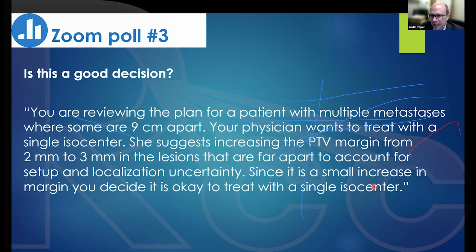Okay, we have a good response right now. I'm going to share these results. I can see that the majority of people have selected no. Some people selected yes, and some people were scared to choose yes or no, so they said maybe. By the way, this actually has happened to me. This is the reason I'm putting it here. When you think 2 to 3 millimeters, it's a millimeter. What's the big deal? Well, let's see.